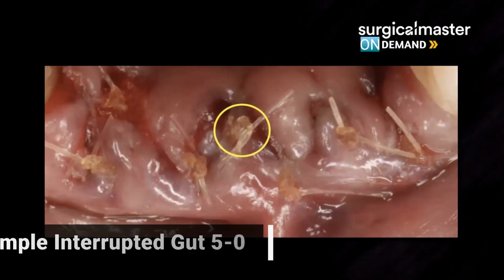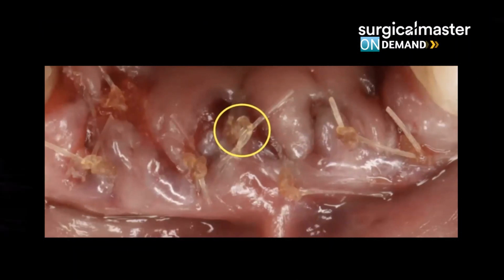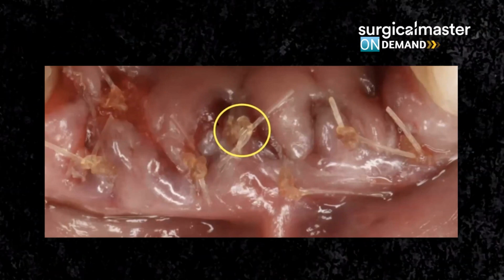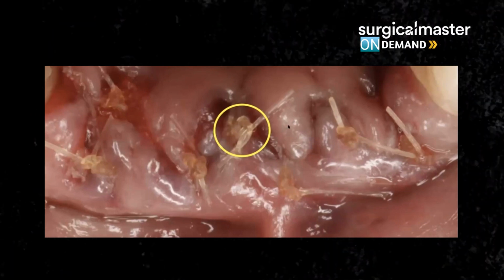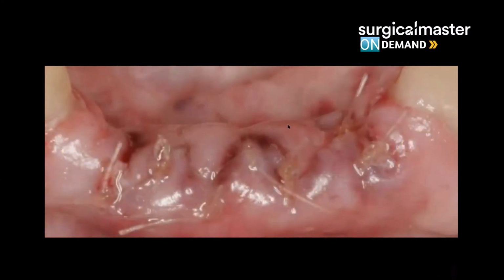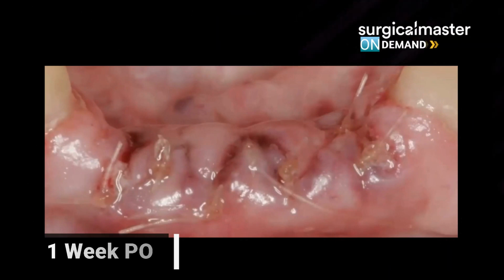I always recommend you start from the middle, okay, kind of split the difference. So if you have a full extent of a, let's call it a surgical site, the area that will be in most tension is going to be in the middle. Then you split the difference again until everything is stable. You can also add some periacryl on top of it. Check out the healing one week later.